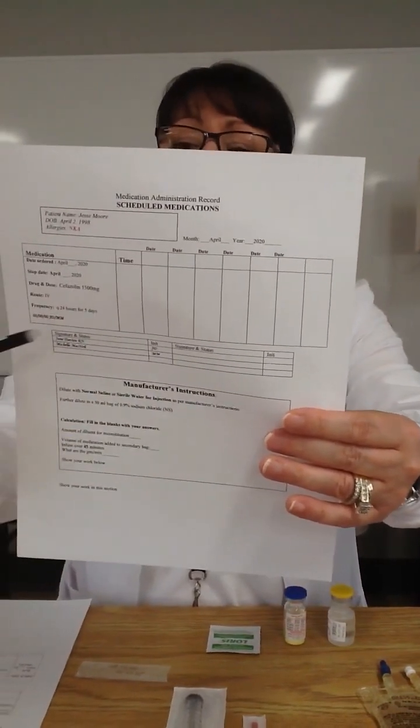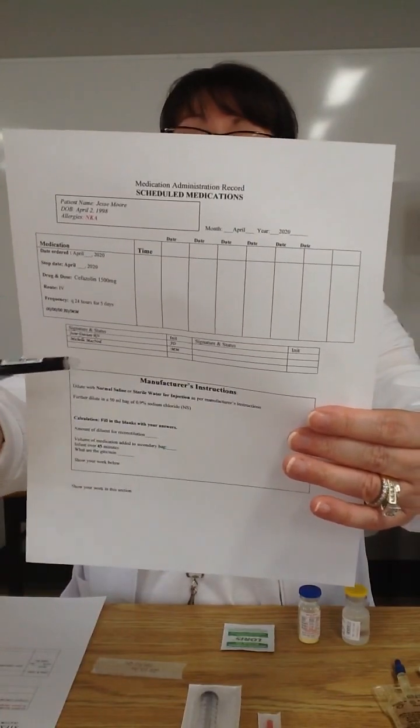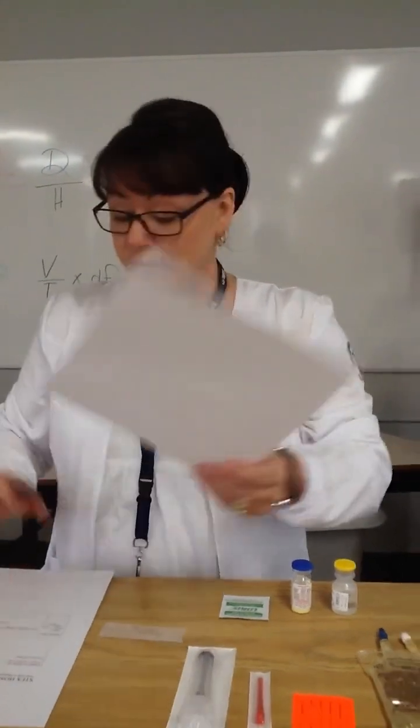Furthermore, I want to see that 2 nurses have gone ahead and checked the accuracy of this order, and that it's been signed with their master signature and their initials, and I can see their initials in the date up here as well. So now I know my MAR is safe to use. I can put that doctor's note aside and I can focus on the MAR.